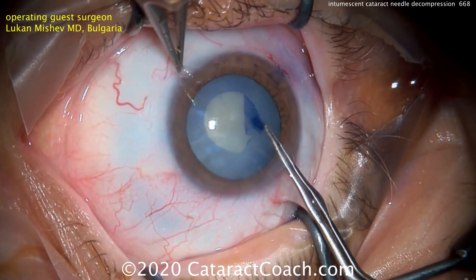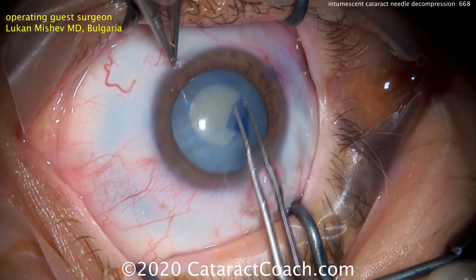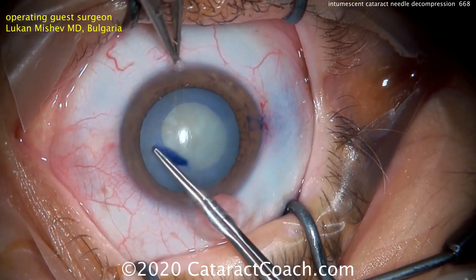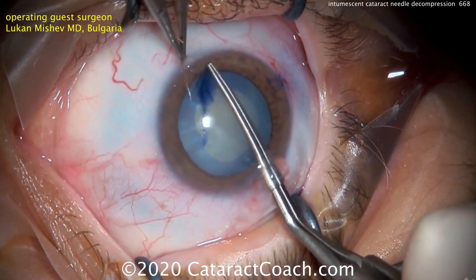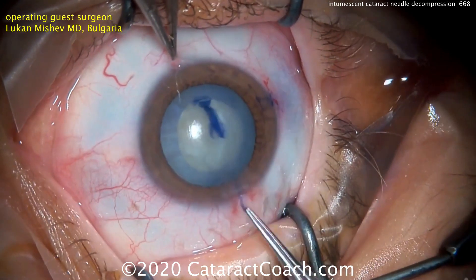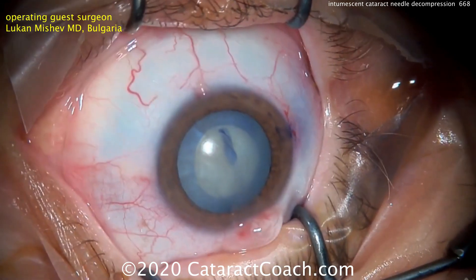As a result, there's no pressure in the capsule bag and we can complete the capsulorhexis without any issue. We've shown previous videos here on Cataract Coach of other techniques for dealing with these white cataracts and creating a capsulorhexis without the risk of Argentinian flag sign, or at least minimizing it.